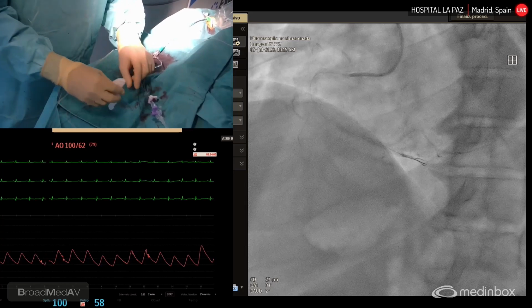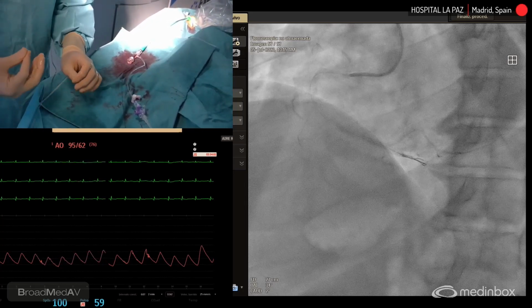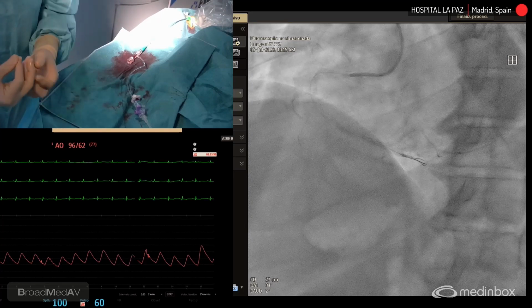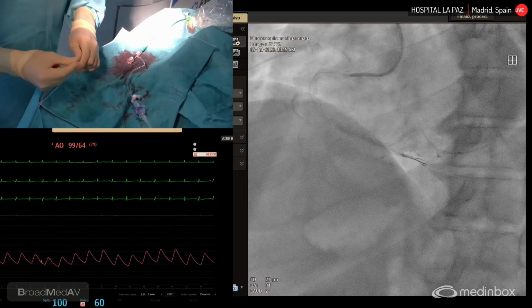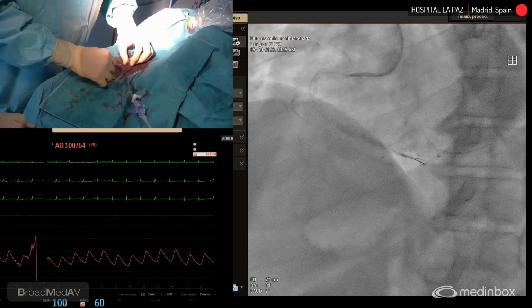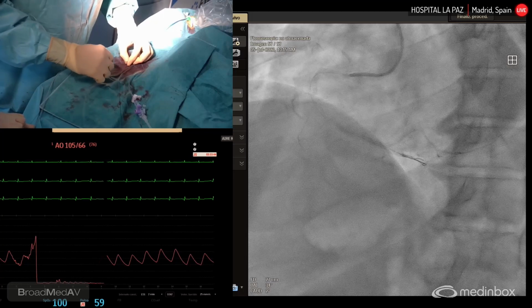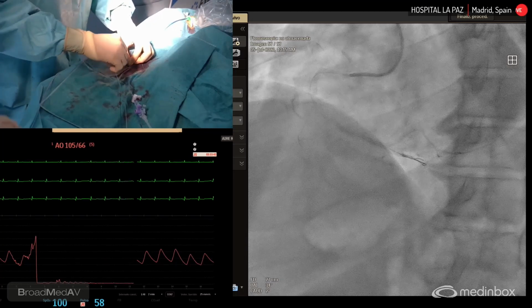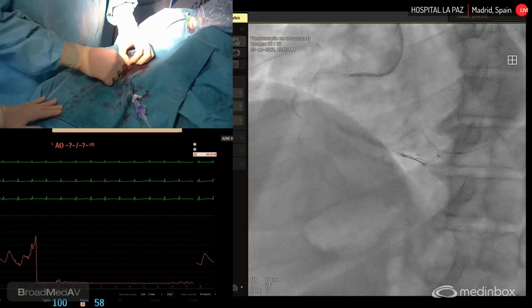There are several techniques to apply laser energy. The best is a constant clearing with saline to avoid complications. It's a safer way. And in case it's necessary, you can perform without saline or even with contrast to obtain a high power to modify resistant plaques.